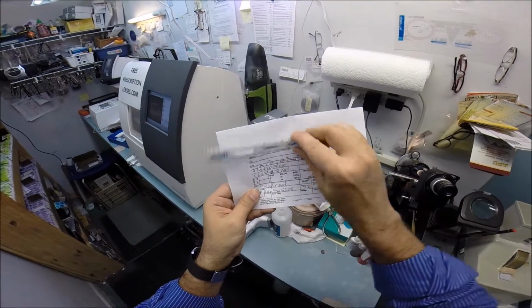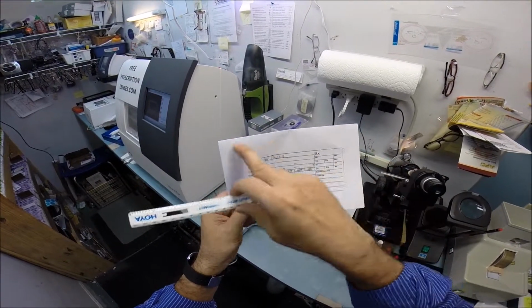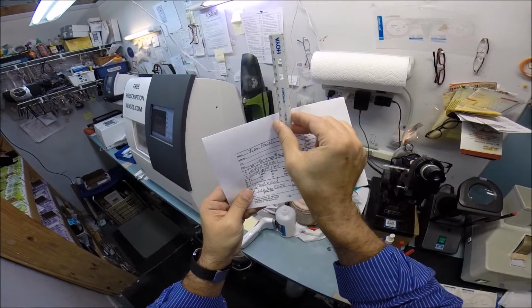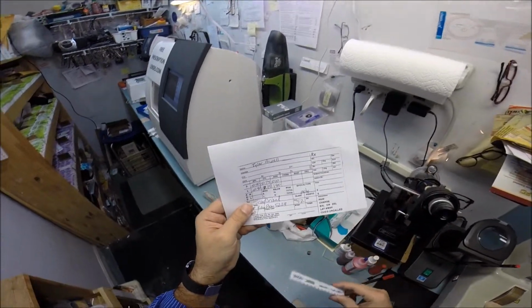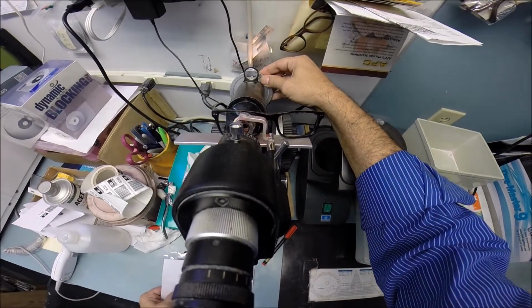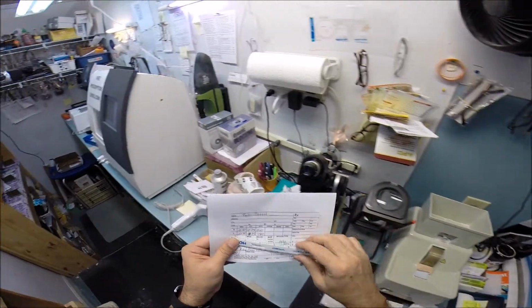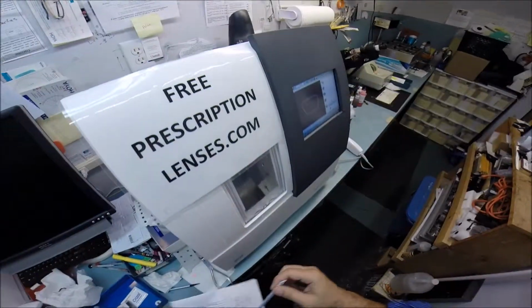If you think of a knob, the volume knob, the fine-tune knob, and a straight line being from 0 to 180, or better yet 1 to 180, we're going to turn that knob to 10. For your left eye, we're not turning it anywhere. It's staying on the 180. The 90 meridian is the vertical. 0 and 180 are the same line. So even though 10 and 180 look far apart on a number wheel, we have 10, 9, 8, 7, 6 to 0. Then we start back over at 170, 175, 0. So you're only 10 digits apart, even though 10 and 180 look like they're miles apart.